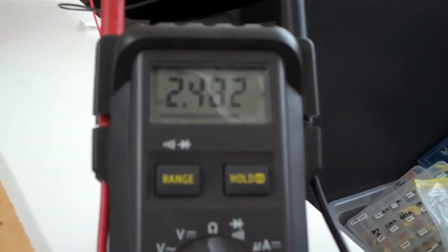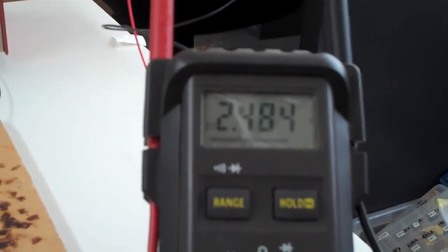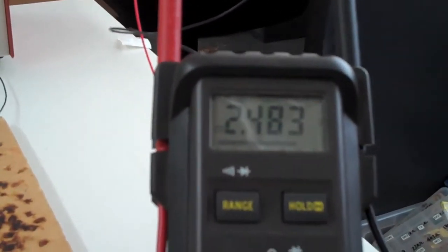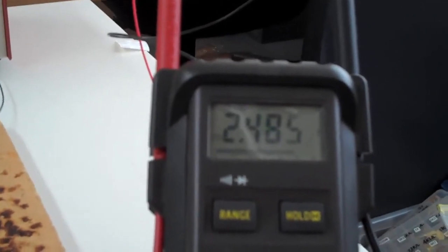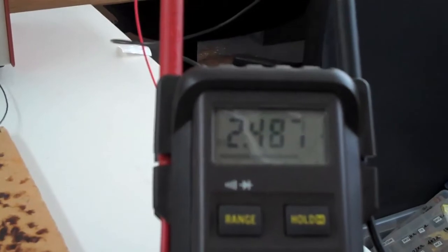And I'm just monitoring here. You can see the voltage output of the op amp here. As you see, without any breathing, I'm getting around 2.5 volts.